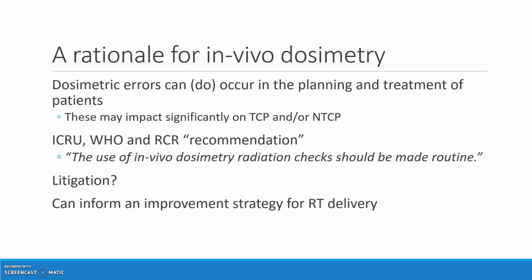Now, you will know from your own experiences that they're not routine. I would imagine that many of you don't routinely use diodes, TLDs or transit dosimetry to check the dose that you're delivering to your patients, and there's probably good reasons for that, which we'll come back to later.